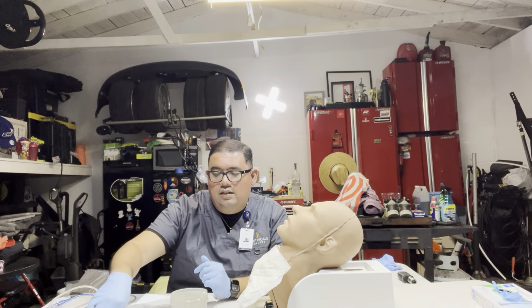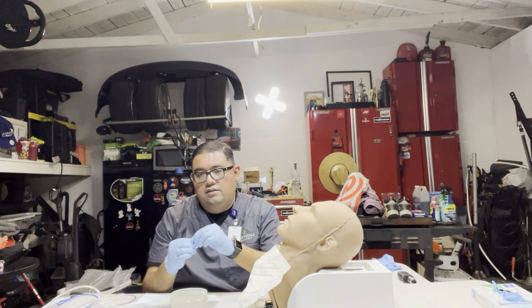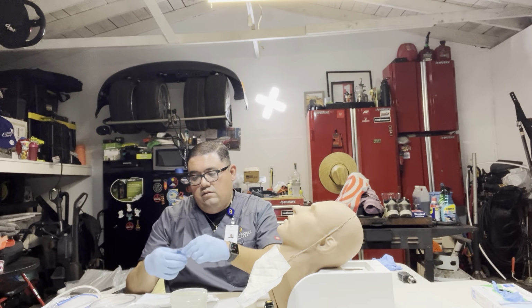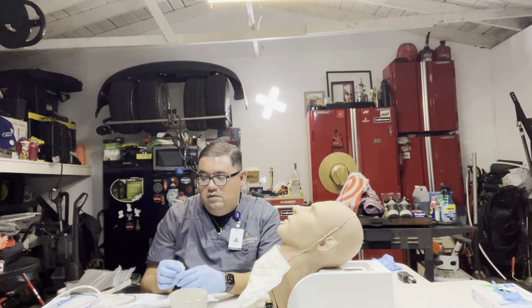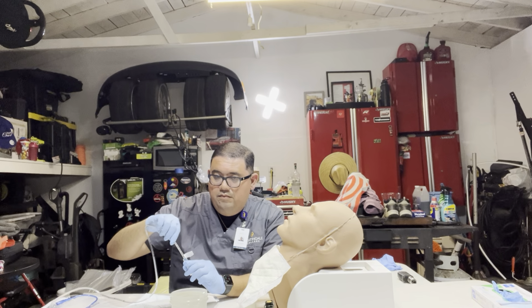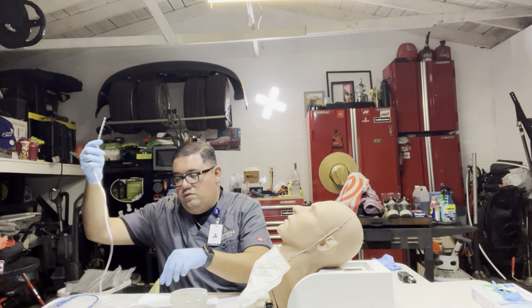Next, I'm going to go ahead and lubricate the tip of the tube. Perfect.